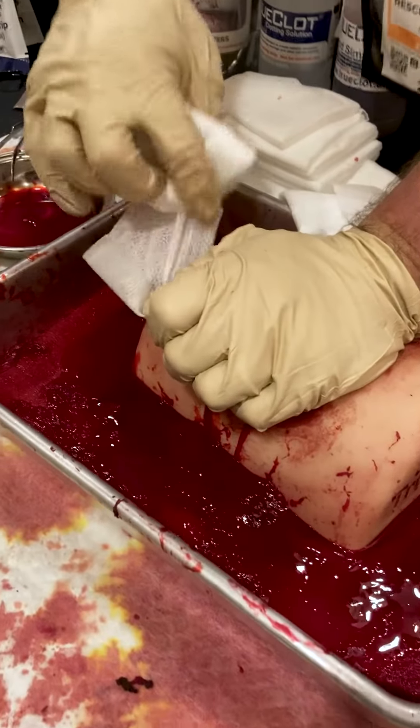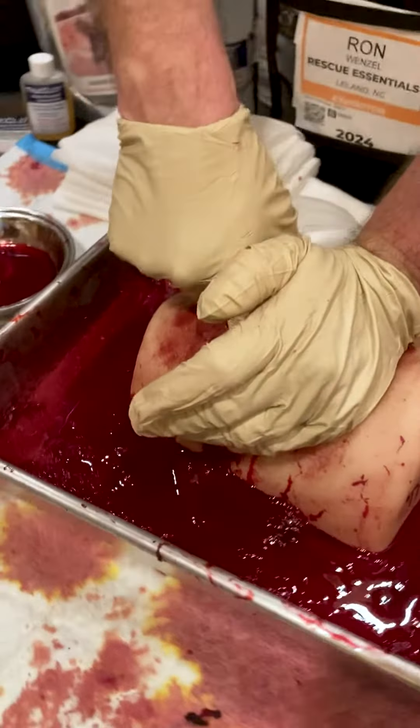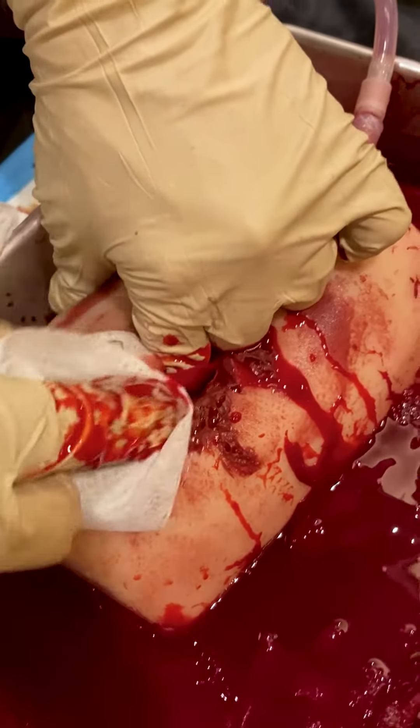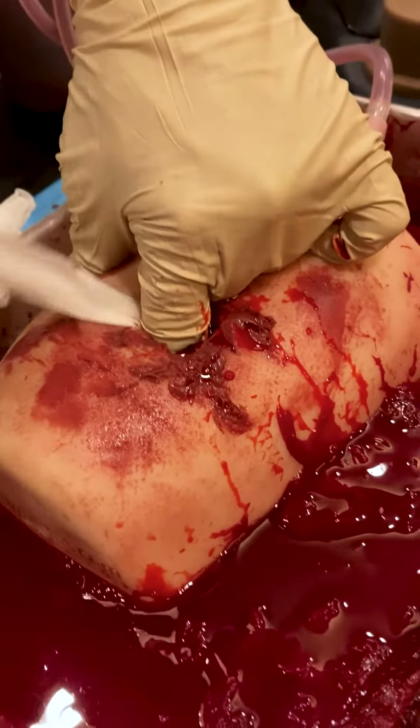Now I get some gauze here and this is simulated hemostatic gauze. Without releasing pressure, I want to go deep into the wound cavity. Look at that wound cavity — pretty substantially, my fingers are gone. And without releasing pressure, I want to slowly and methodically get some gauze in there.